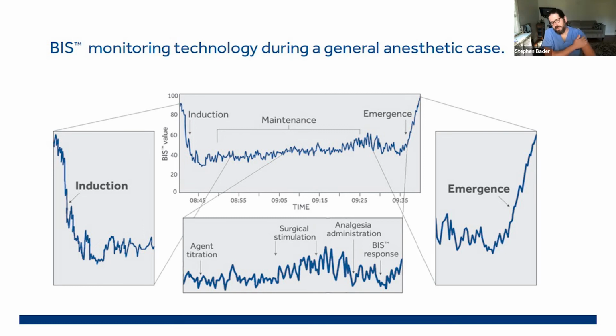So for heart surgery patients in my hospital, we routinely apply the BIS pre-induction, and it is reassuring when we're going to try to get away with using a little less anesthetic agent than usual. On the other hand, there are times when we underdo it, and then you're going to go perform laryngoscopy. The blood pressure is going to go through the roof. So I think having the BIS there as an additional piece of information really does help you avoid either under or overdoing it with your induction agent.